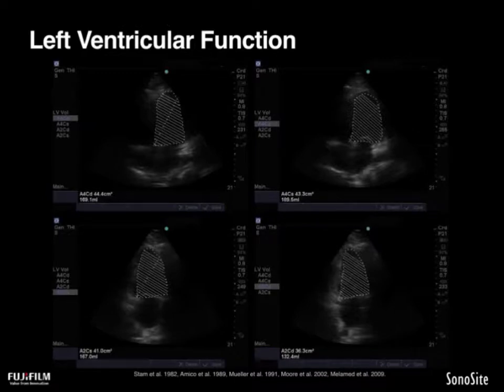Now, while it is appealing to have an exact number, as we will review, an exact number is actually not as helpful as a more broad classification system for the acutely ill patient. For instance, an ejection fraction of 53% is of little meaning to you compared to an ejection fraction of 48% or an ejection fraction of 57% when considering what therapeutic options to entertain in a patient in shock. So the degree of absolute quantity can be a little more than we're actually looking for. I hope to convince you of this as we continue forward.